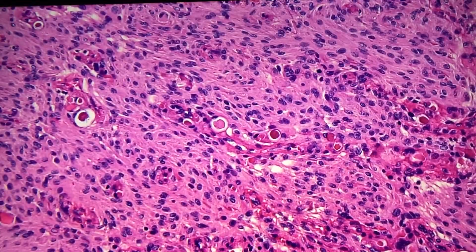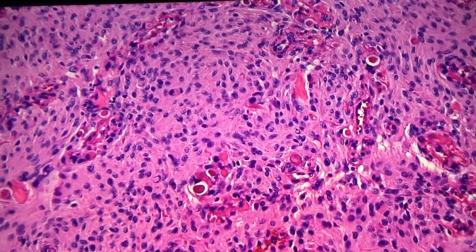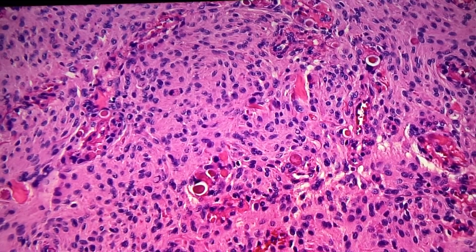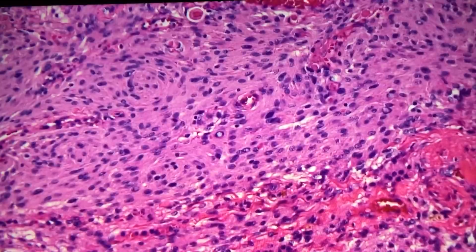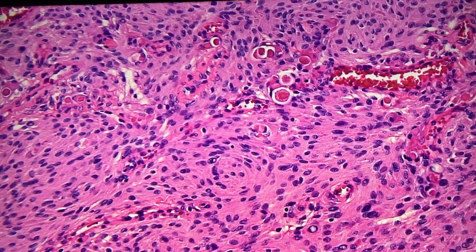So what can we learn about this case? Erika? These things are called pseudo-psammoma bodies. They're intracytoplasmic inclusions. They stain with PAS and CEA. These are grade 1 meningiomas. They otherwise look like a typical meningioma. They can have clinically a lot of surrounding edema that's been reported in these cases.